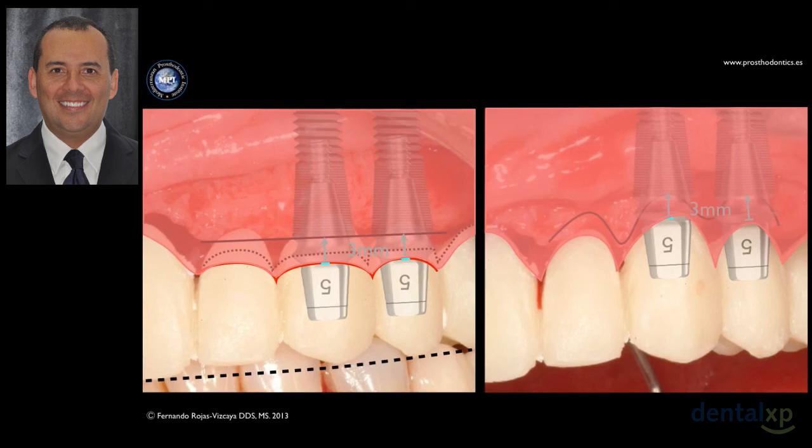But now on one side you have a short lateral, short canine, short first premolar, and in the area where you place the implant guided by the prosthesis, you have the correct length of the lateral, canine and premolar. And in both cases maybe you have the same molar, because in both cases you place the implant at the level of the bone in the area of the molar.